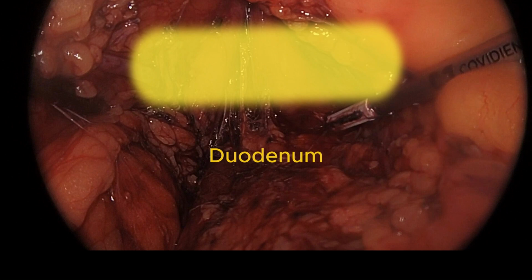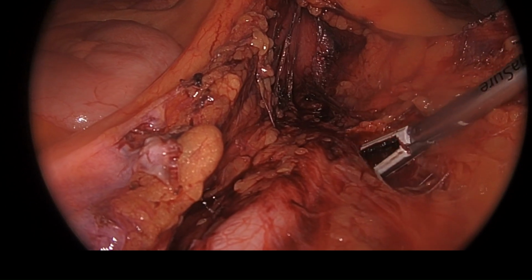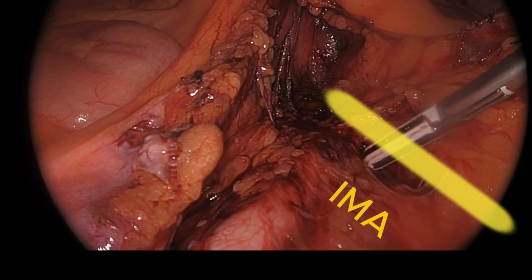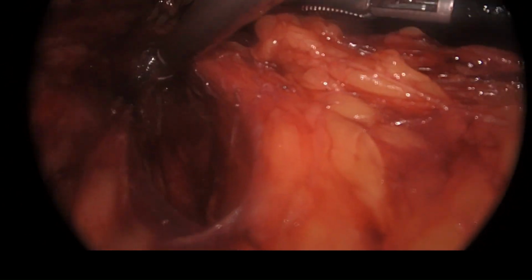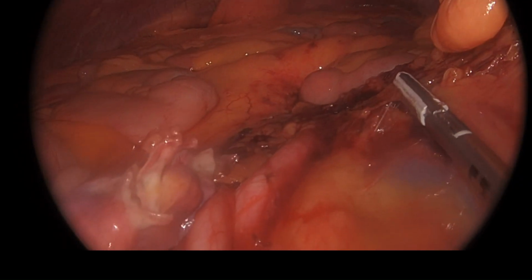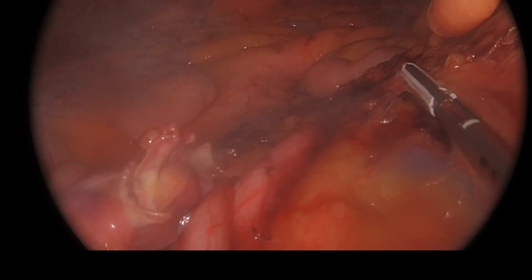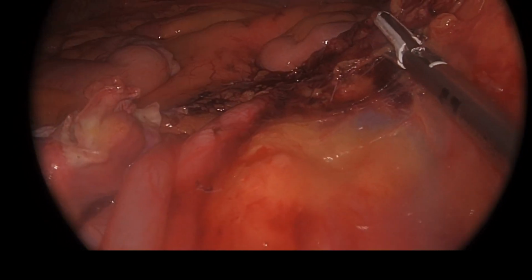Duodenum is an important anatomical structure for paraaortic lymphadenectomy. Another important structure that needs to be protected is the inferior mesenteric artery. Inferior mesenteric artery dissection was performed carefully, and the hypogastric nerve fibers were preserved.